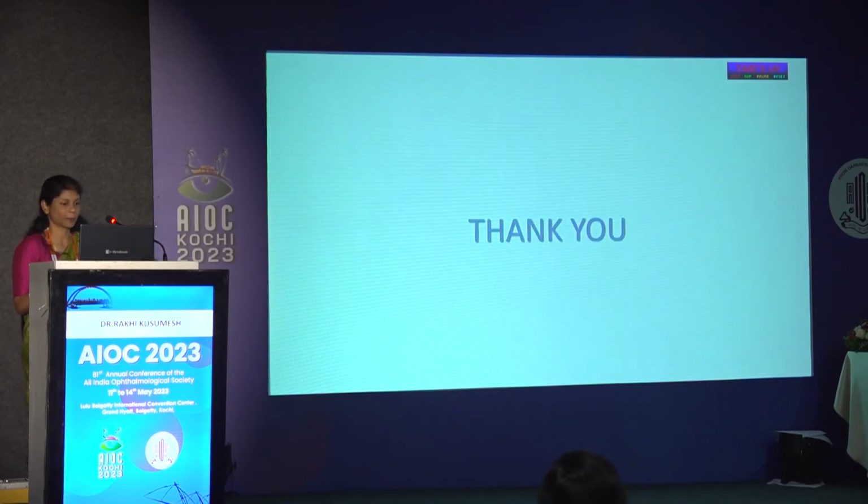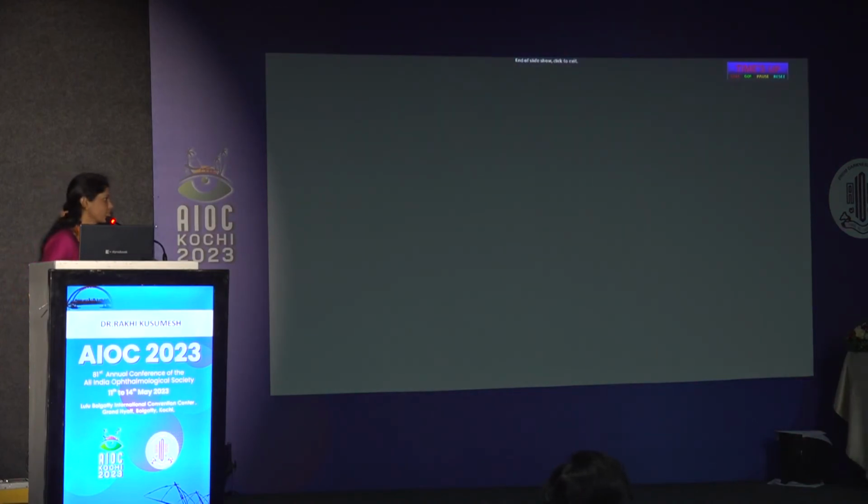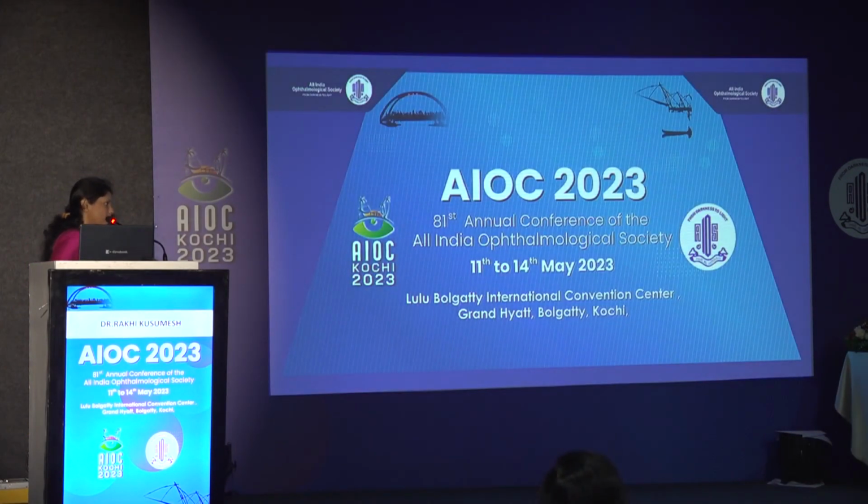Thank you. So, Rakhi, do you advocate all cataract cases to be taken for specular before surgery? Or is clinical evaluation or slit lamp biomicroscopy good enough to supplement the information?